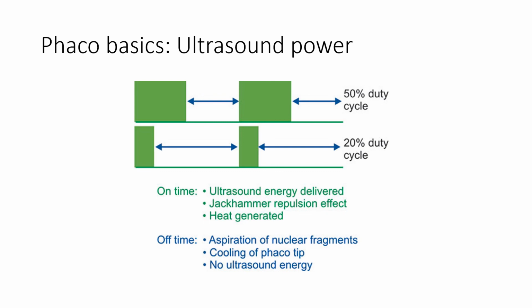So all this is about the very basics of ultrasound or phacoemulsification machines, and there are various techniques which are popular, and that can be another session, but right now we are done with the basics of phacoemulsification.